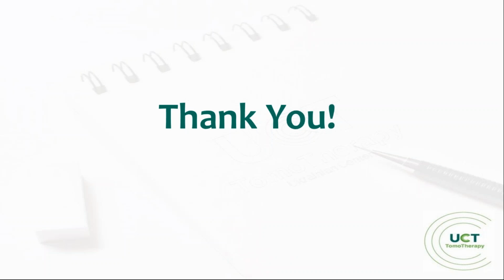Thank you very much, Dimitro, for such an informative talk. It's really impressive. What I really liked is that you are thinking as if you have the radiation source, and you can see exactly the angles that the radiation should enter the body.